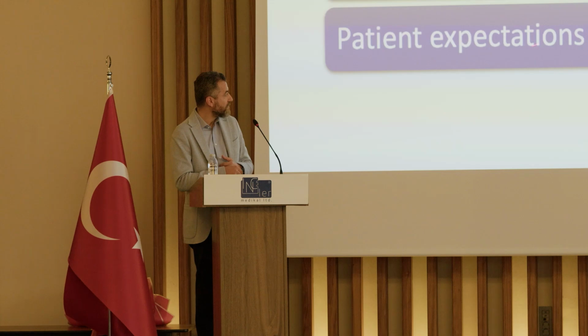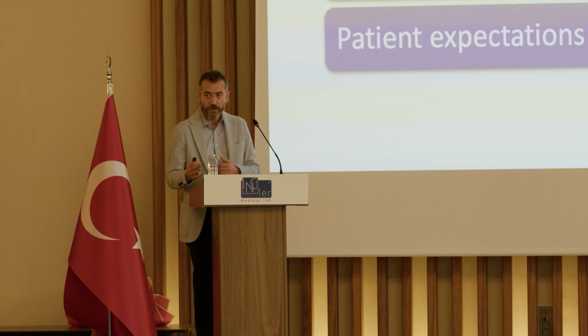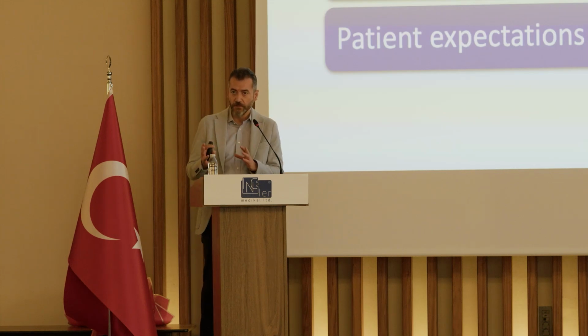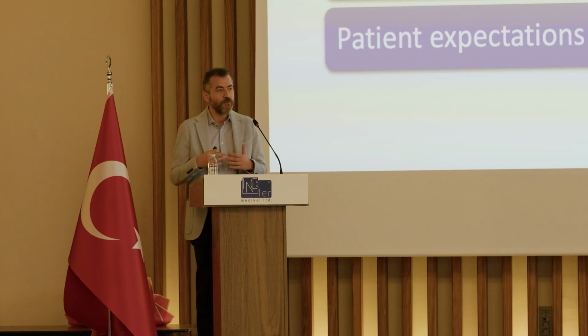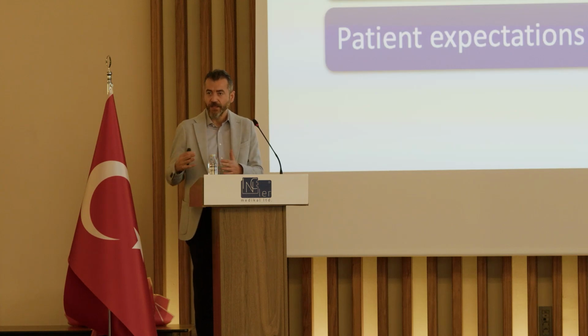And of course, patient expectations are important. With shockwave lithotripsy, we disintegrate the stone in the body, and the stone needs to be expelled by the patient. So they do not want it. When you do a PCNL, you take the fragments out of the body, and the patient is stone-free immediately after the operation. So patients also expect better outcomes after the procedure.